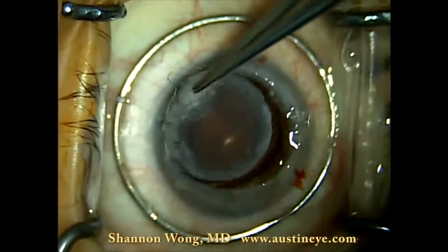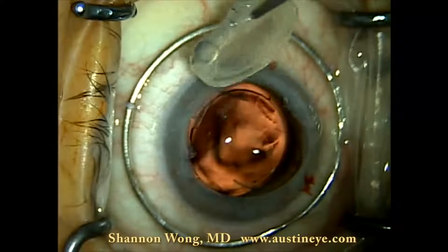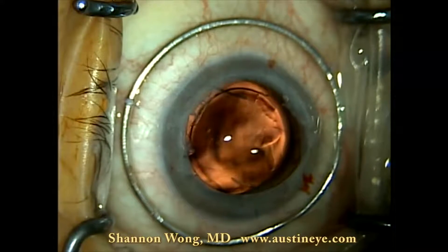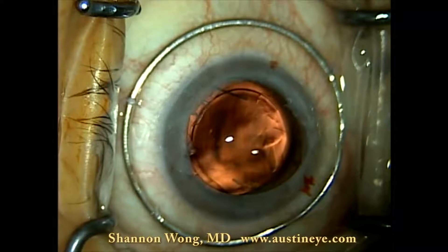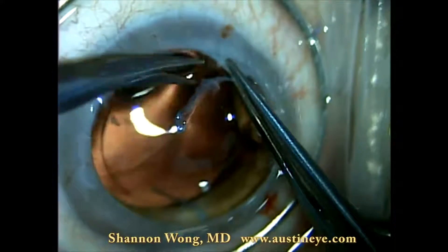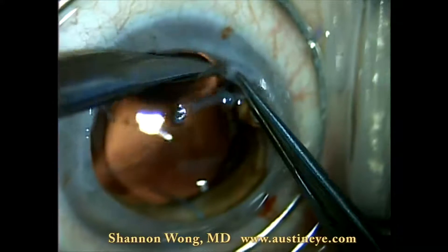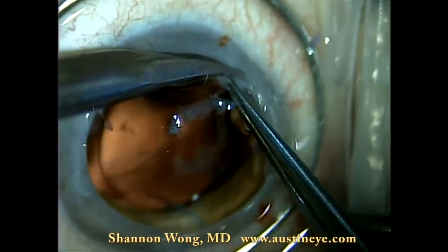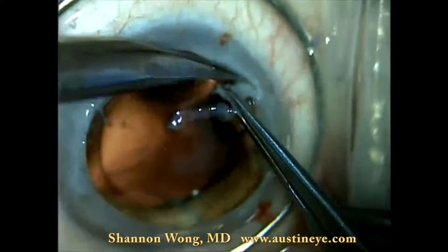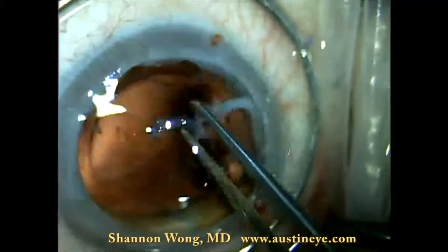The lens was placed into the anterior chamber angle rather than the posterior chamber. Here we remove the original donor cornea and we can see the lens implant — the haptics are indeed anterior to the iris. We then proceed to trim the corneal slivers that remained from the original surgery.